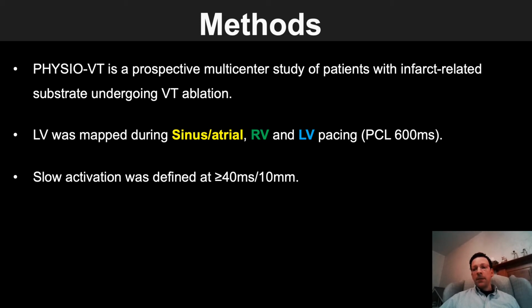Electroanatomic mapping systems allow for the visualization of endocardial activation times in terms of isochrones. For example, when isochrone width is set to 10 milliseconds, any location with 4 or more isochrones within a 10 millimeter segment will be a region of slow conduction.